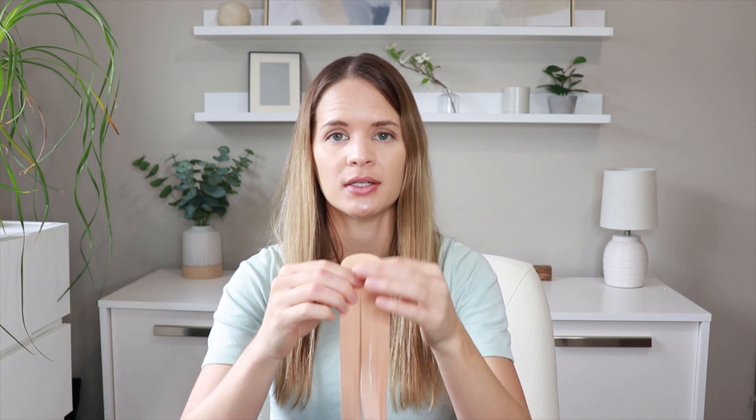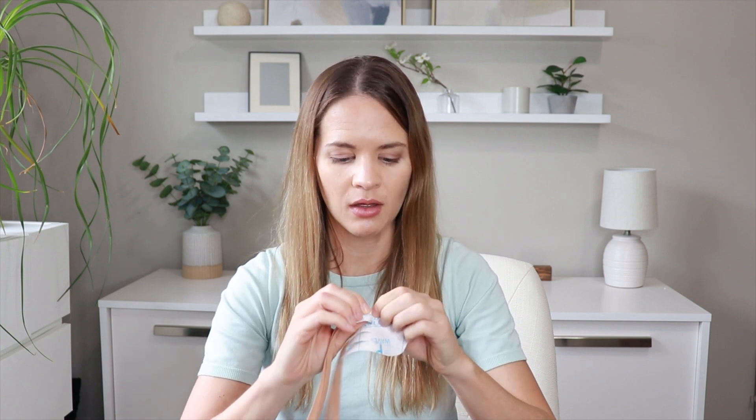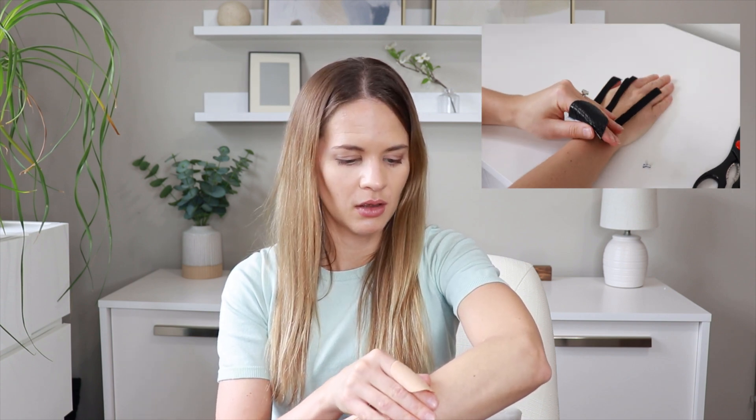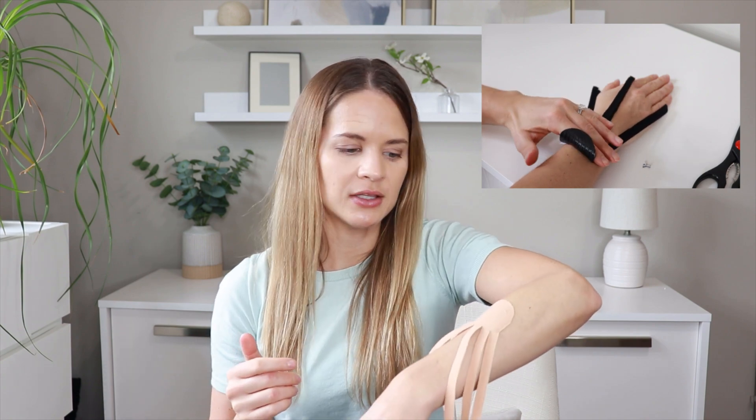We want the anchor — the one to two inch section — to be at the top, up towards where the fluid is going to be guided out of the arm. We're going to tear off the paper from that top piece, then place it down targeting at least mid forearm, adjusting as needed. In order to keep this down and activate the adhesive, you want to rub it because the warmth helps to activate it. Be careful on the edges not to pull them up — just rub it in place.